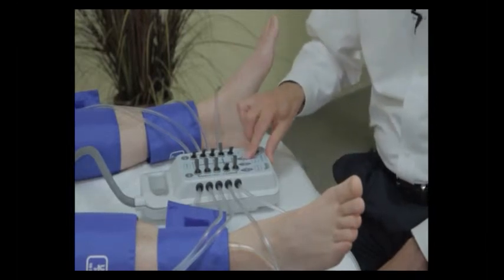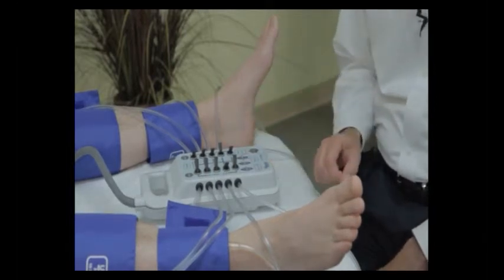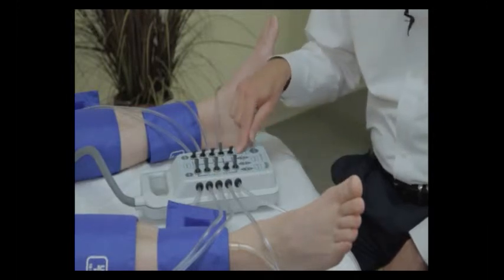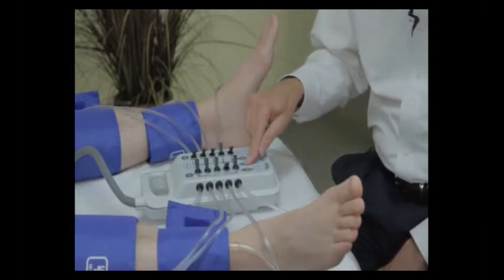If I want to move one at a time, I can use my side button and scroll just the left side.